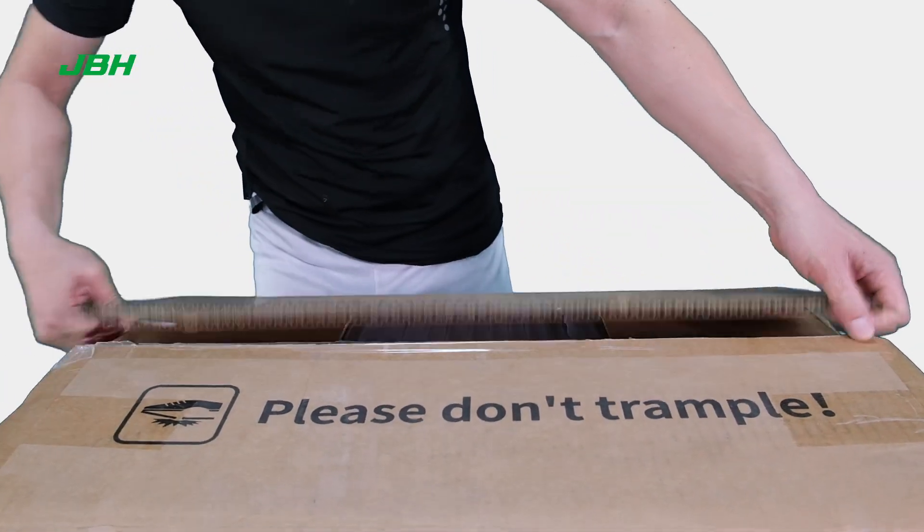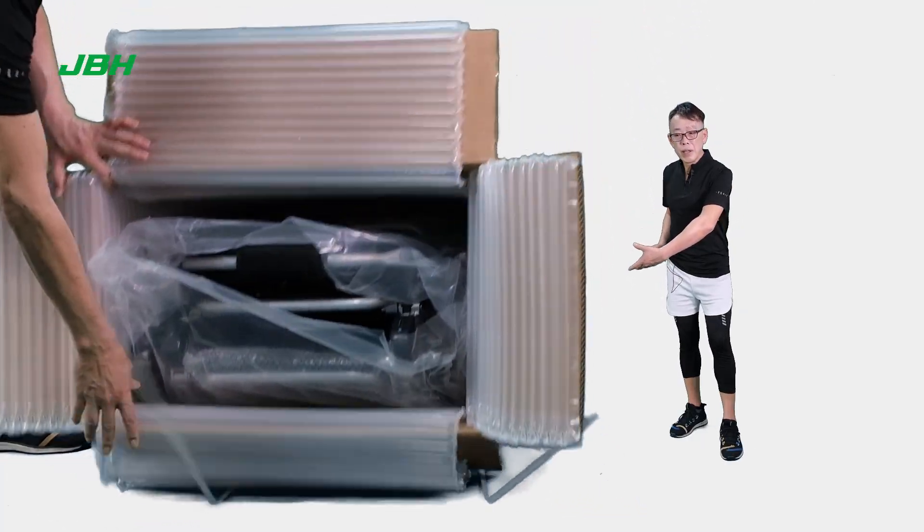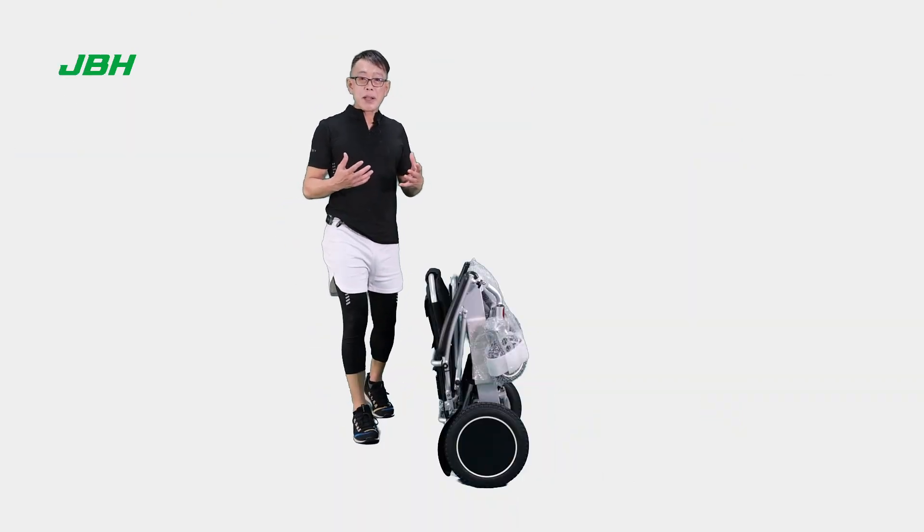First of all, let's cut the top and also the tape off. Then we can lay the whole carton down, drag it out. We have got the wheelchair out of the carton.